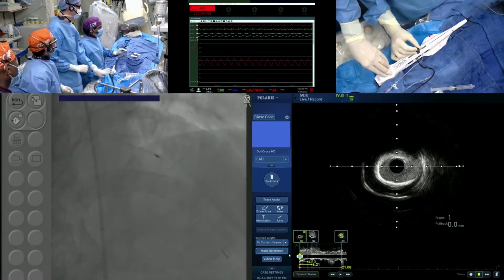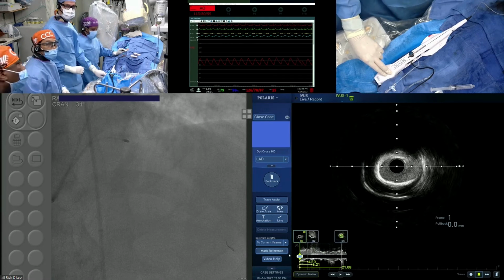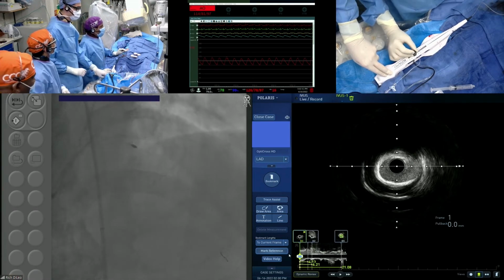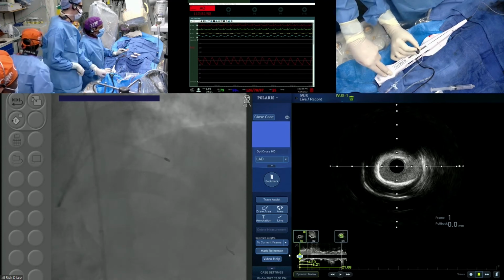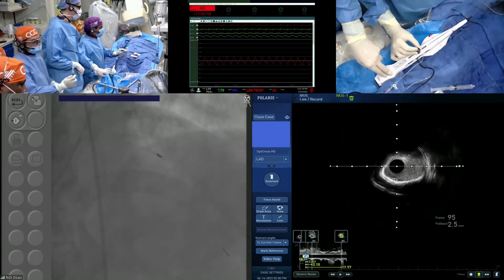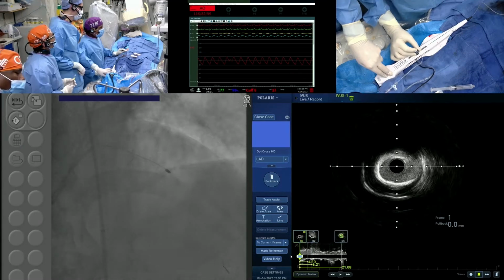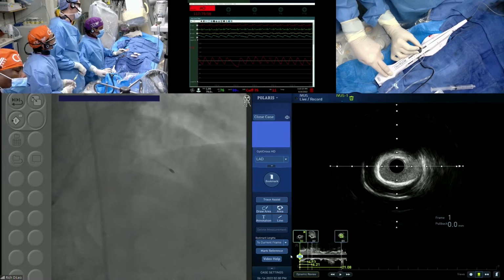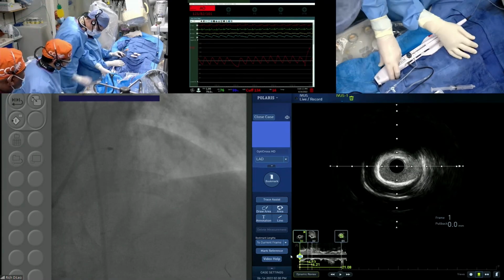Is it different if it was a pseudo-aneurysm versus an aneurysm? Because I think that part you need to take into consideration. Just to go over that again, there is a lot of calcium distally. If it's a pseudo-aneurysm, you would never put an atherectomy catheter next to it. Go ahead, John. You really need to be listening to the burr sound, because even the pitch will tell you when you're going to stall. It's the first thing that you react to. It's not the odometer, it's not the speed on the machine. It really is your ears.